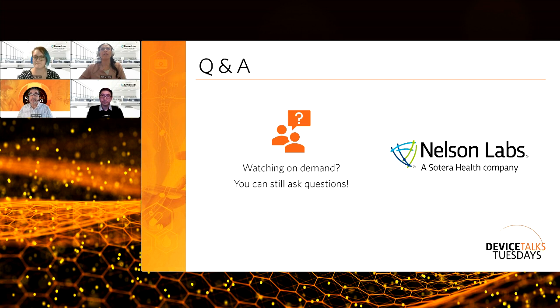Yeah, I would also add there is a requirement for MDR that we test at end of life. So we want to look at the end of shelf life, end of processing, and that's a heavy focus for MDR. It's also in 10993 Part 1 where we talk about that as well. What we don't want to have happen is for biocomp testing to be done twice, where it's on a freshly manufactured device and an aged device. That's just a lot of burden on the animals and on manufacturers. So we want to really try to assess any possible risk from the aging or reprocessing process.